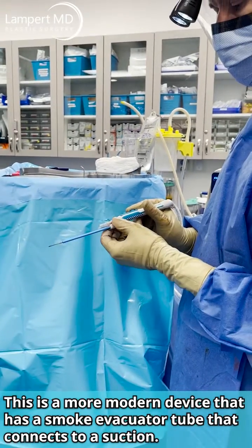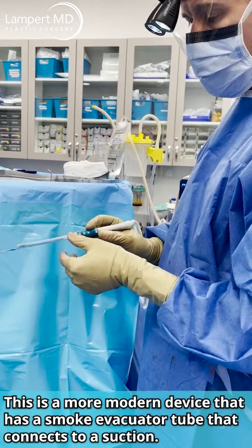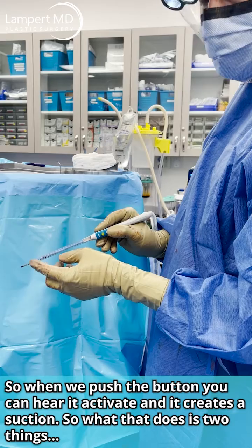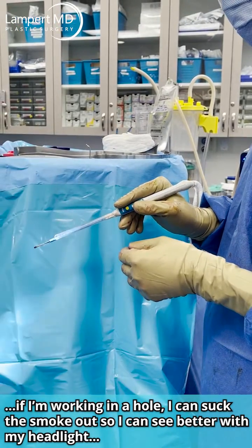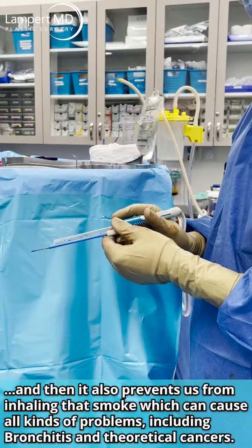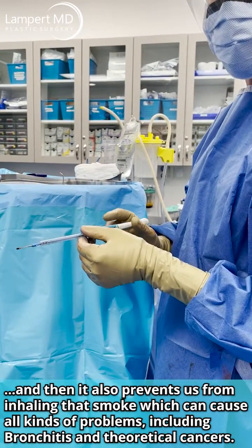This is a more modern device that has a smoke evacuator tube that connects to suction. When we push the button, it activates and creates suction. This does two things: if I'm working in a hole, I can suck the smoke out so I can see better with my headlight, and it also prevents us from inhaling smoke, which can cause bronchitis, theoretical cancers, and that type of thing.